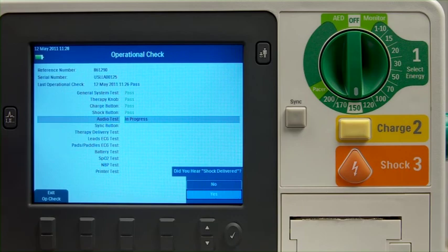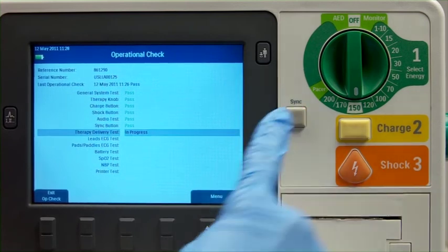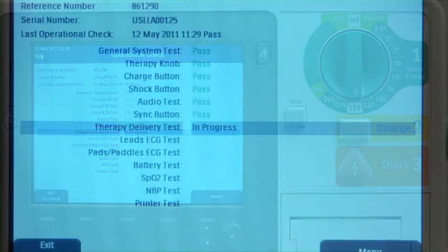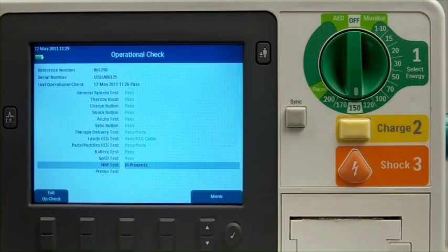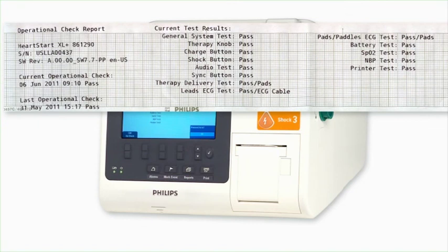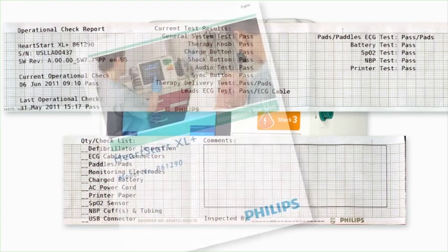As each test is run, the message window displays 'in progress.' When prompted, follow the on-screen instructions. You are given a pass or fail indication upon completion of each test. When the Op Check is done, a report is printed automatically if configured. The first part of the report lists test results. The second part lists additional checks you should do to make sure that you have the necessary supplies and accessories and they are all in good working order. For details about these additional checks, consult the instructions for use.